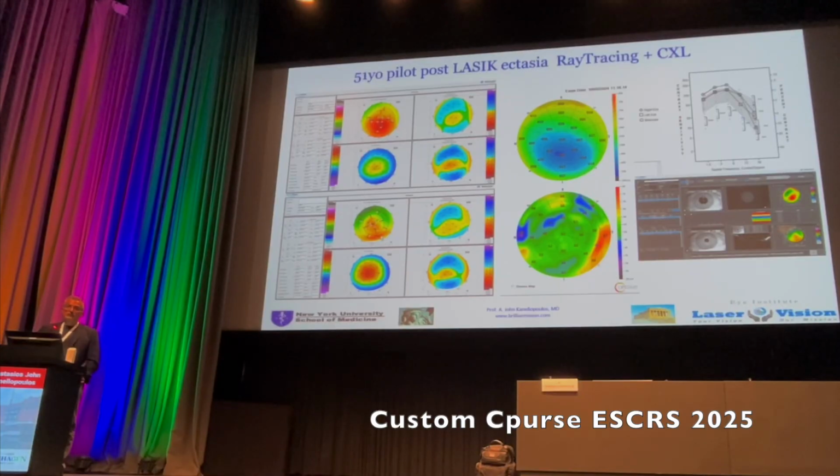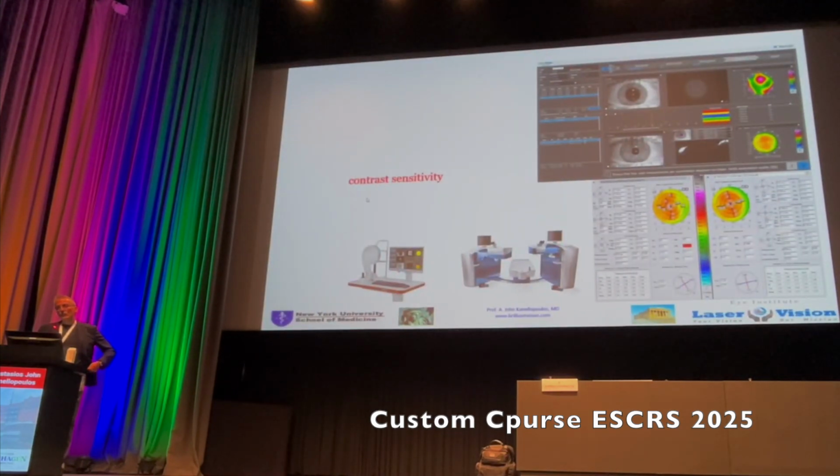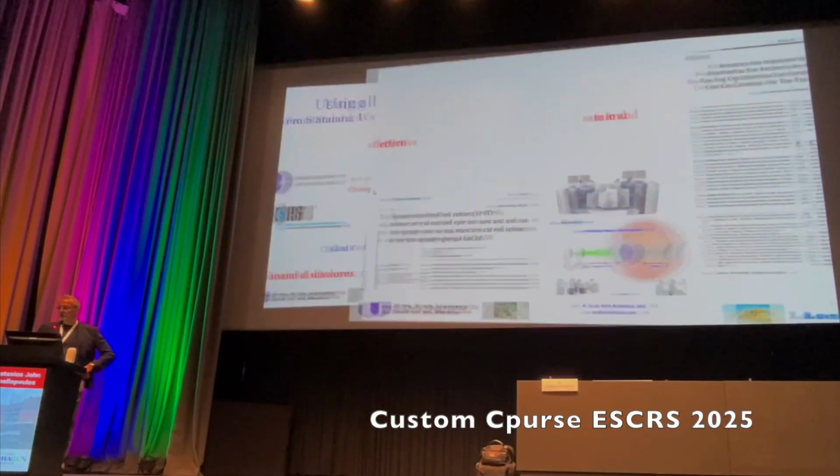Dr. Candelabros, fix my keratoconus, and I need to pass a vision test at 20/20 without telling anybody that I have keratoconus. We're able to do this in 2-step Athens protocol and then ray tracing enhancement, but that's not always the case. Of course, we discussed with this gentleman that that's an impossible task, and you may need to wear glasses, you may need to have a second procedure.